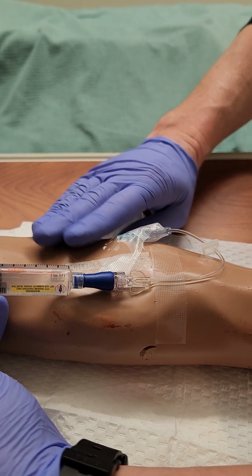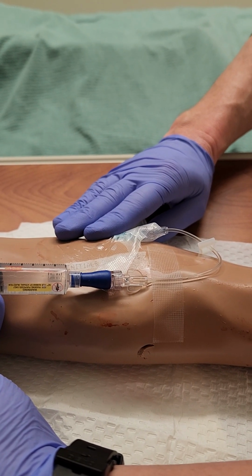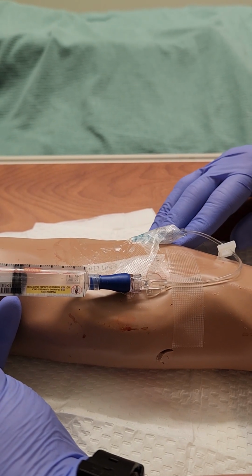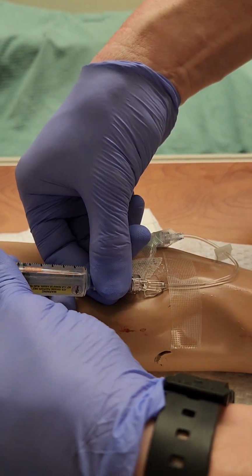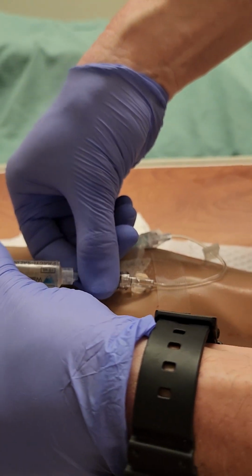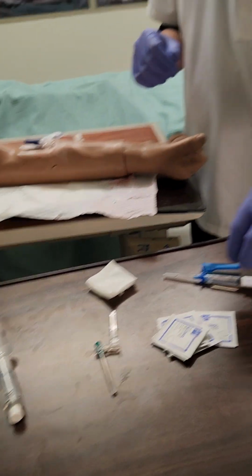I want to make sure I'm not causing the patient any pain. I want to make sure that there's no swelling. There's all those things. So put like 2 to 3 milliliters of saline in there by flush, and then I can go ahead and discard that one.